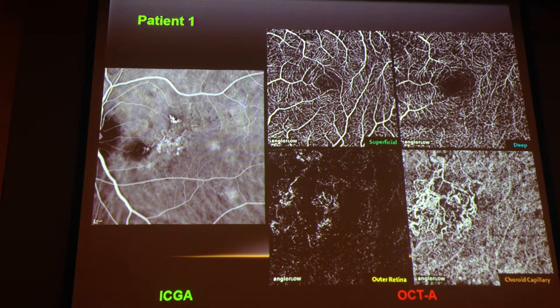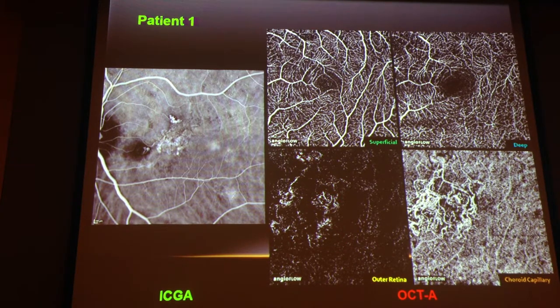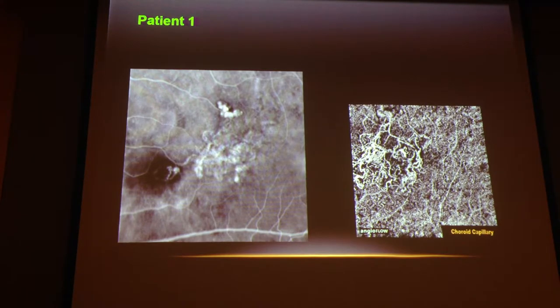Here's one of our patients. On the left, the ICG angiogram; on the right, the four layers of the OCT angiogram. We see polyps here and here, as well as the BVN. The superficial and deep layers look normal. When we get to the outer retina, we see some outlines of the BVN and perhaps the polyps. On the choriocapillaris, we see the BVN very nicely, as well as the polyps. Magnifying this, we can see that this polyp has a multi-lobulated structure which is mirrored in the OCT angiogram.